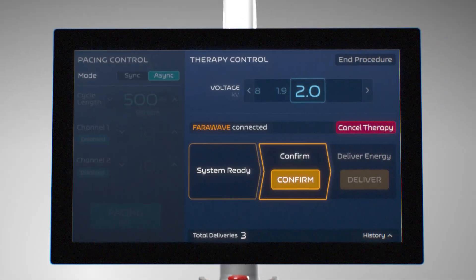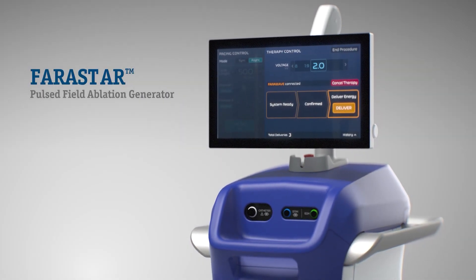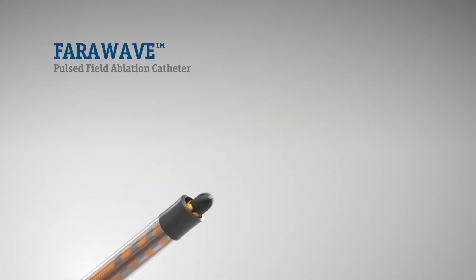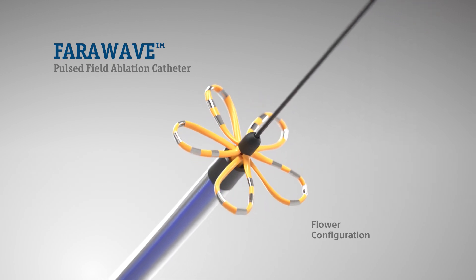Built from the ground up, the Farapulse PFA system is comprised of the Farastar Bipolar and Biphasic Waveform Generator, Faradrive Steerable Sheath, and Farawave Over-the-Wire PFA Catheter with adaptable distal shapes to treat a range of pulmonary vein anatomies.